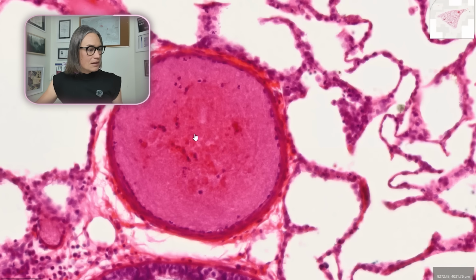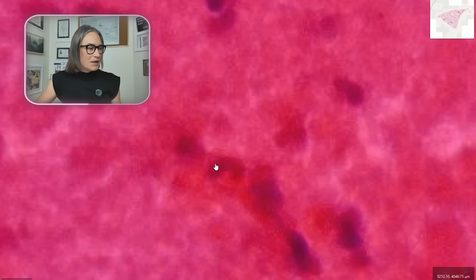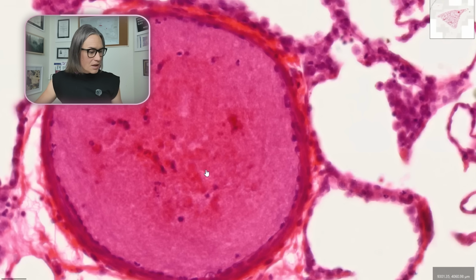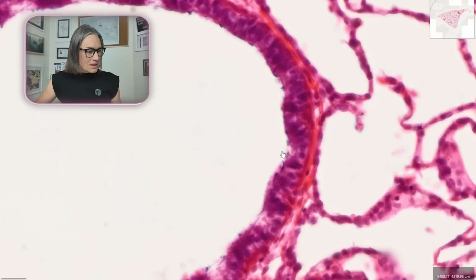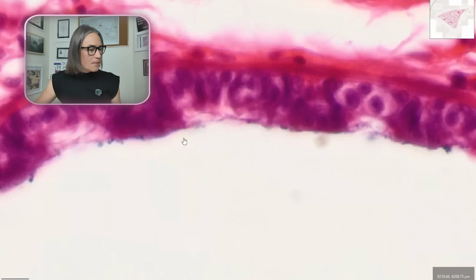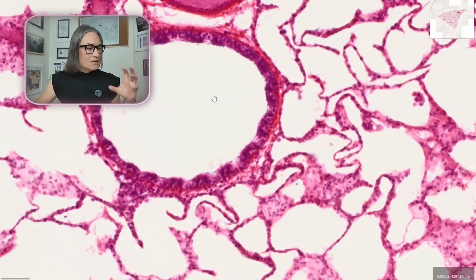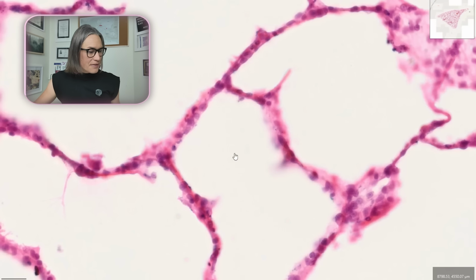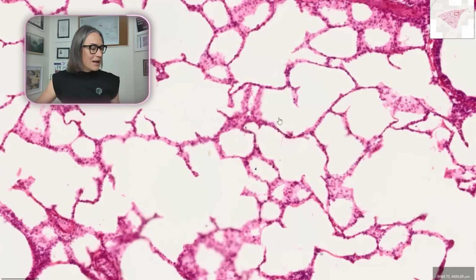So this red blob here is actually blood. I see better the white blood cells with their segmented nuclei. The red blood cells, they just clumped together as pink mass. But this is a vessel. This is an airway, and in an ideal world we would see some cilia here, but we see from the cross section that this is something more sturdy, and these are more flimsy. They're very thin. And if you already know what that is, let me know in the chat.